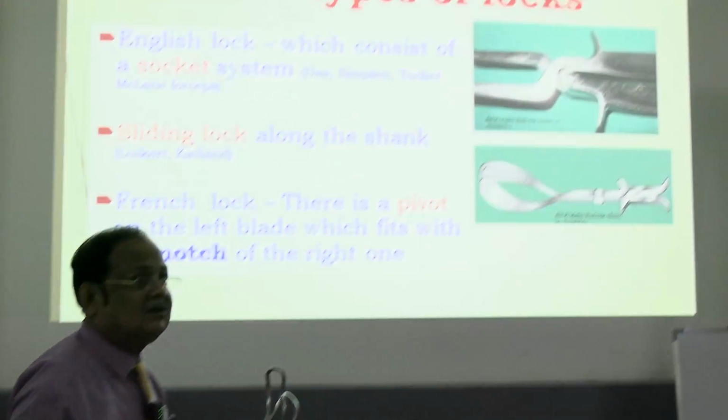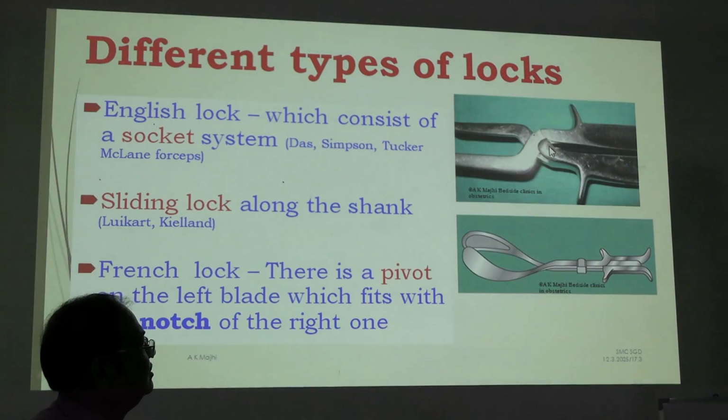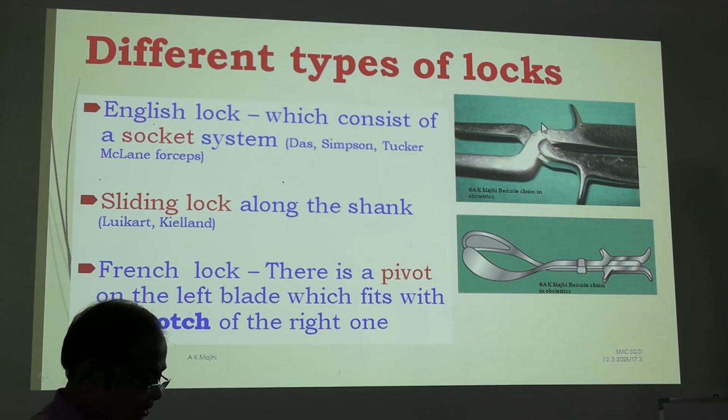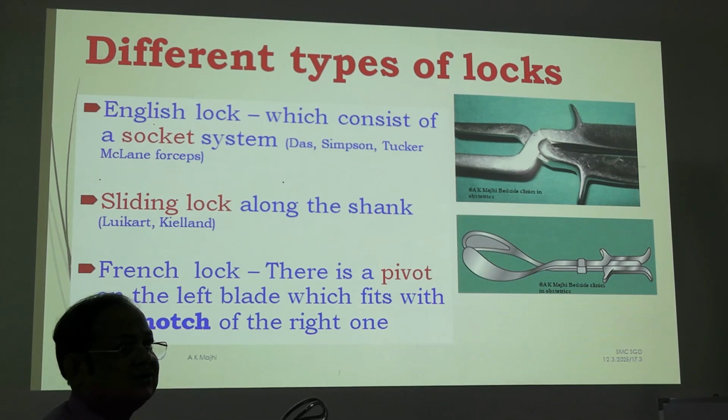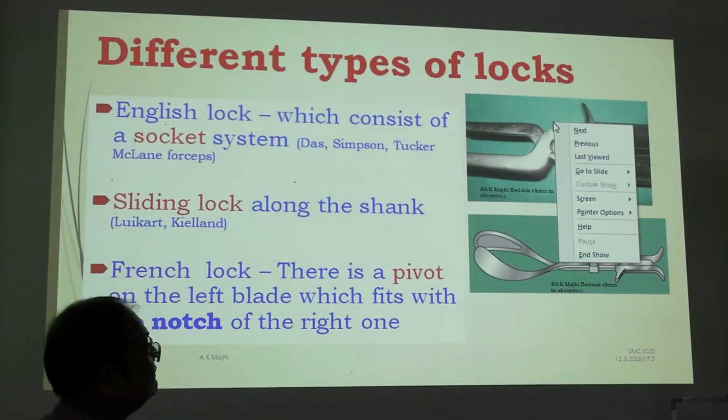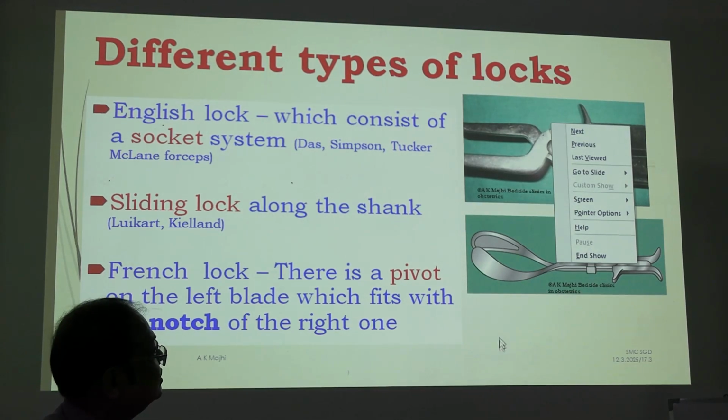This is the sliding lock, commonly used. That is the English lock. This is the English lock, and this is the sliding lock. The English lock is on the right side upper, and this is the sliding lock.